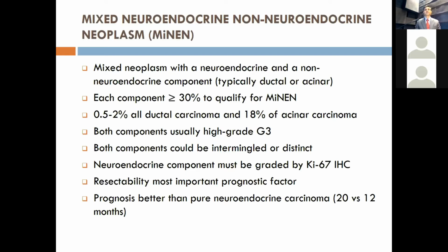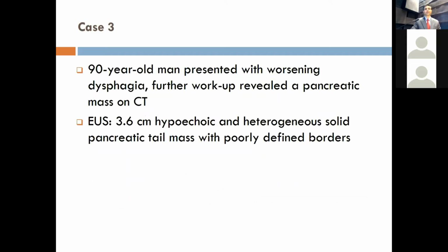Another thing I would like to mention is that immunohistochemistry is essential in diagnosis of these tumors. As you can see, the morphology can be very mixed. It is the application of immunohistochemical stains that will get you the right diagnosis.